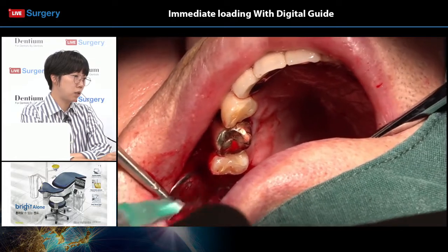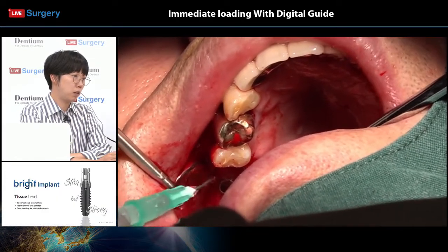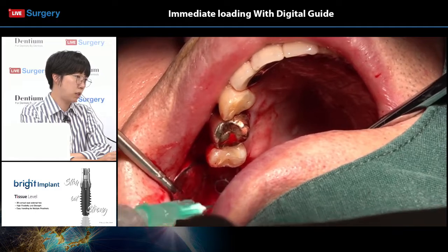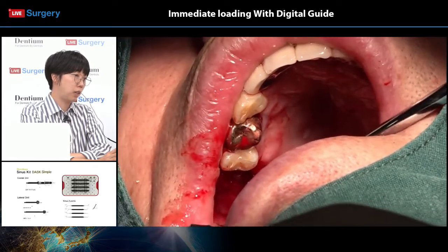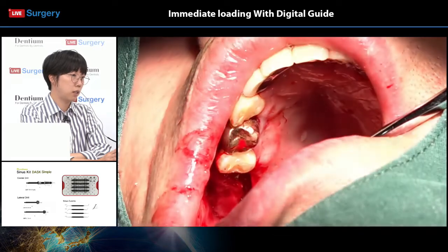Okay, so Dr. Lee has administered a little more local anesthesia that would slow or lessen the bleeding in the surgical site.